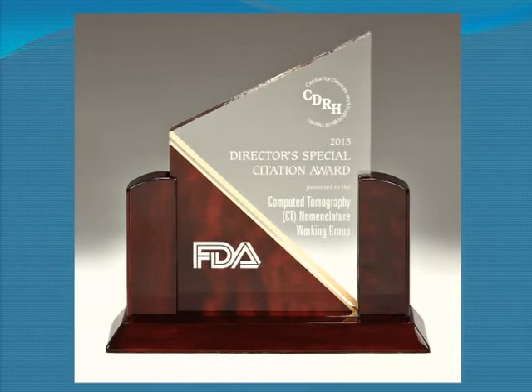Yes? What's your opinion on weight-based protocols? Okay, so the question was, how do you size categorize your protocols? And lots of folks use weight. We see, weight, even height and weight together, don't always tell the story. You can use the height and weight to calculate something called body mass index.